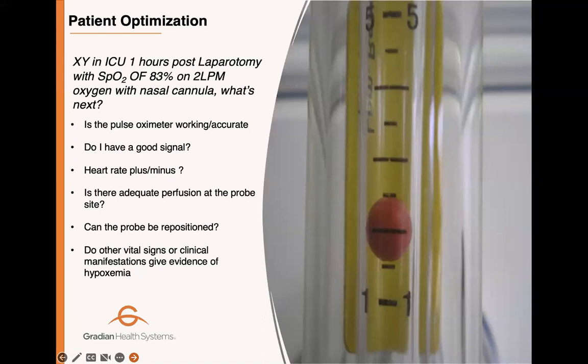Heart rate, plus or minus, is the heart rate okay? Is there adequate perfusion at the probe? Can the probe be repositioned? Do other vital signs or clinical manifestations give evidence of hypoxemia? So you have to ask yourself questions before you act and get that reason. Next slide.